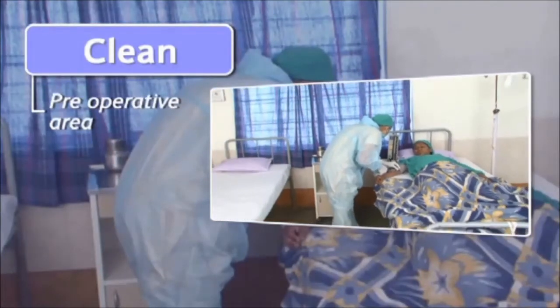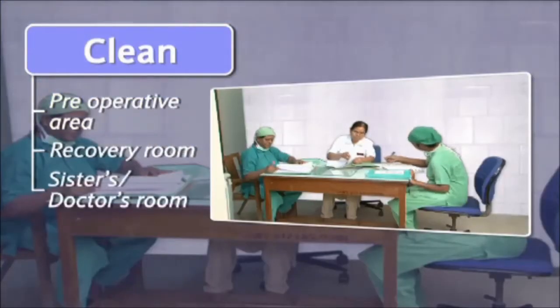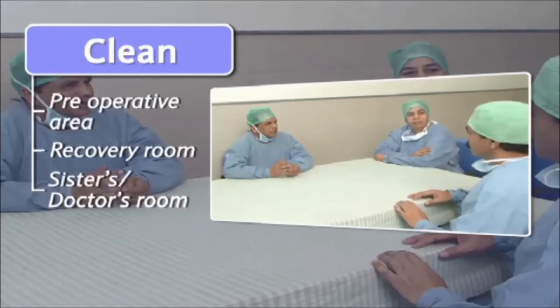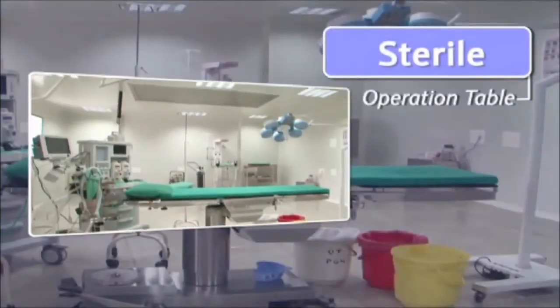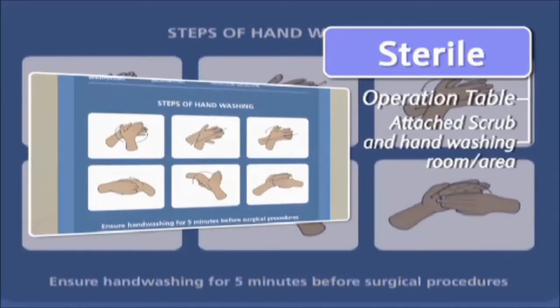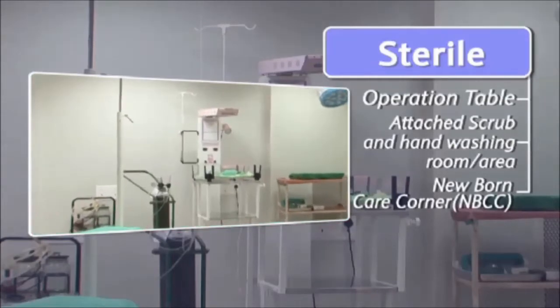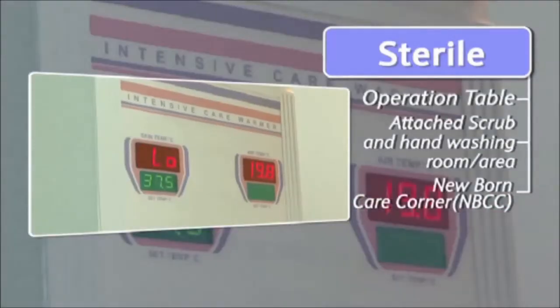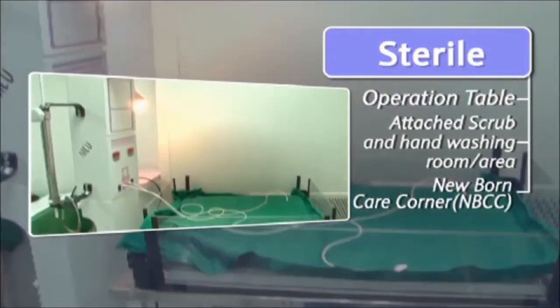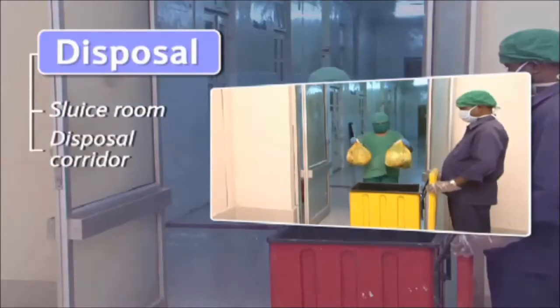Similarly, the clean area includes the pre-operative area, recovery room, and sister's or doctor's room. The sterile zone contains the operation table, scrub and hand washing area, and newborn care corner.